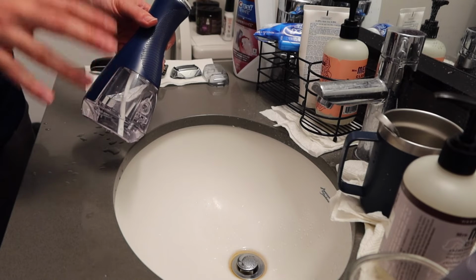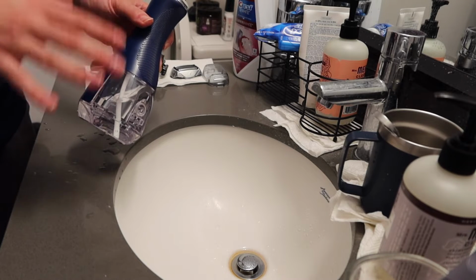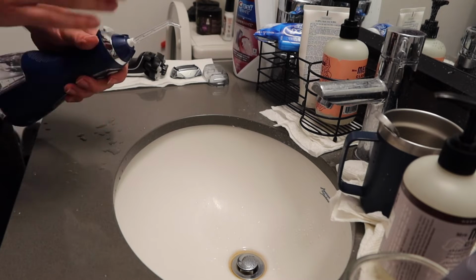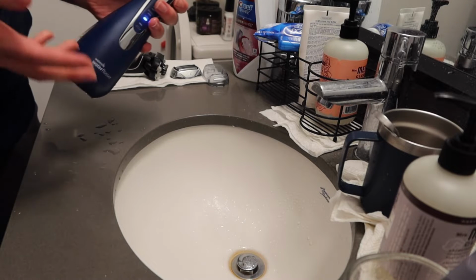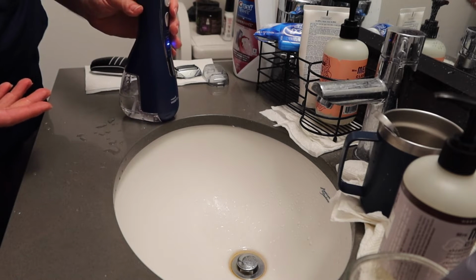So I'm assuming each time you use it, that is basically what it meant in terms of 45 seconds. So I'm going to run it a few more times before I put it onto my teeth. Alright, so that should be good. Now let's try it on myself to see how it works. When you use the product, you do want to make sure you close your mouth. So just like this.